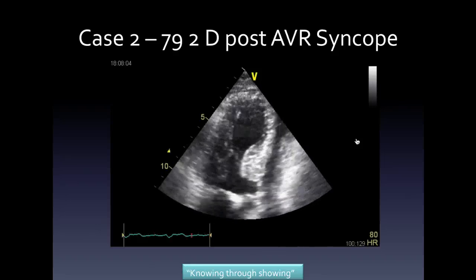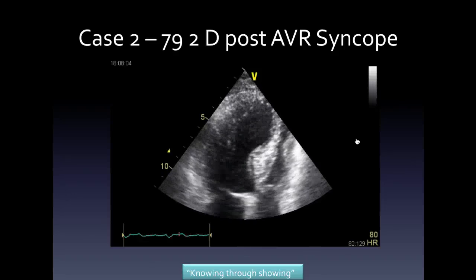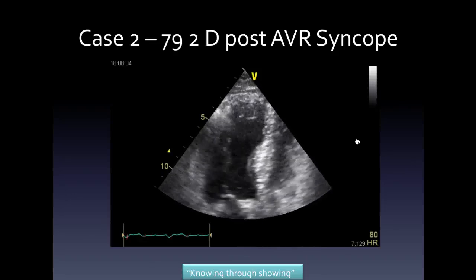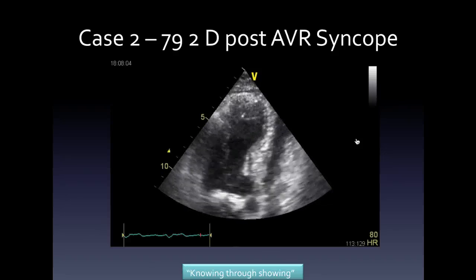And I would caution you against saying with definitiveness that his ventricle is good, bad, or indifferent. I just throw that up to say, that's just the one shot. Just be careful on the one shot. And you correctly didn't fall for it and make a comment on his ejection fraction.